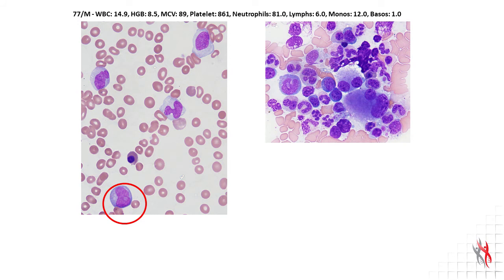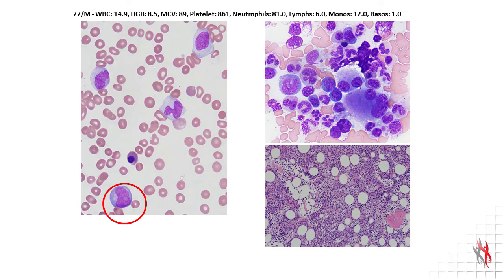This patient eventually had a bone marrow evaluation that showed dysplasia in all three lineages: the megakaryocytic lineage, the granulocytic lineage, as well as the erythroid lineage. This is an image from the patient's bone marrow core biopsy, which was decalcified and examined under the microscope. You can see here that the bone marrow is very hypercellular, with a cellularity of about 90%, which in a patient who is 77 years old, is in excess of what one would normally typically see.